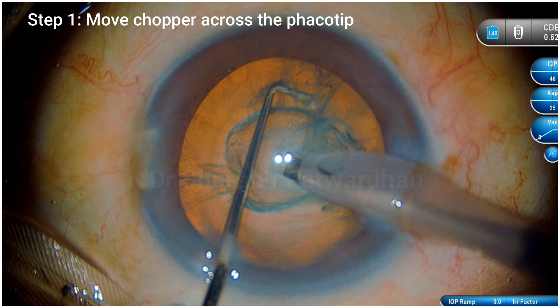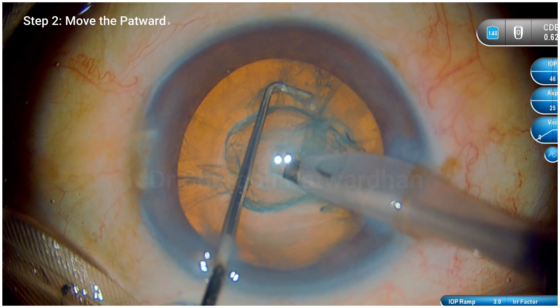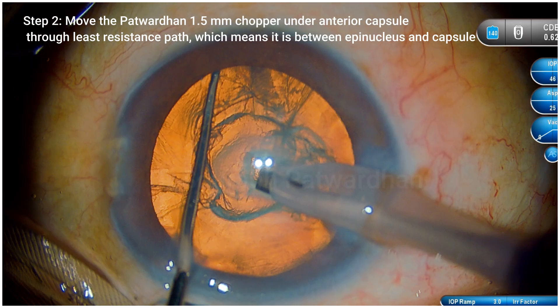The chopper is going under the capsule. Mind you, this is 1.5 mm long and it does not have a sharp end. Now, move this 1.5 mm chopper under the anterior capsule through the least resistance path, which means you are between the epinucleus and the capsule.